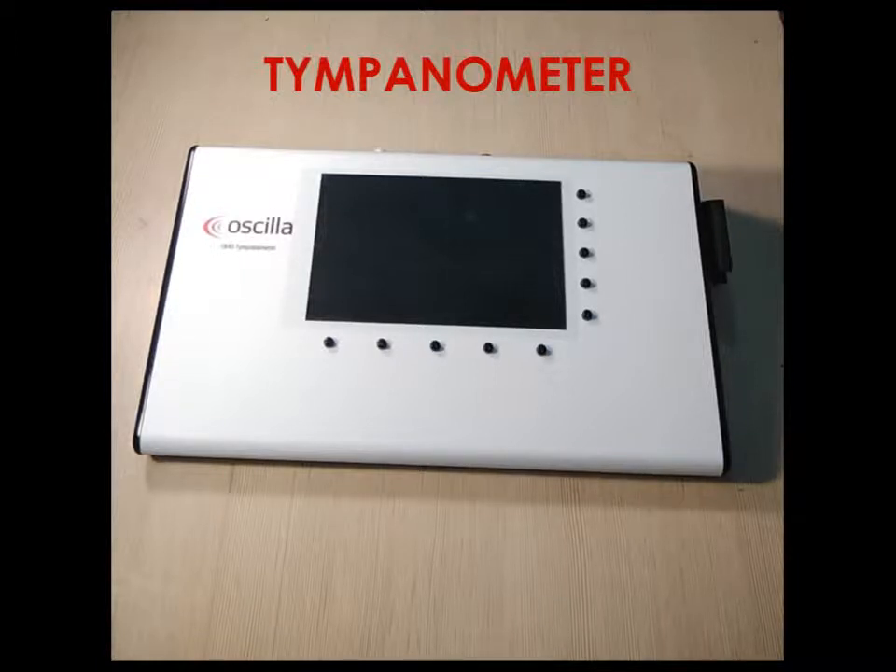Hello, this video is for the demonstration and installation of the tympanometer T830 and T840. The T830 and T840 are almost similar in functionality — they are both the same, except that the T840 model has an additional contra reflex function.